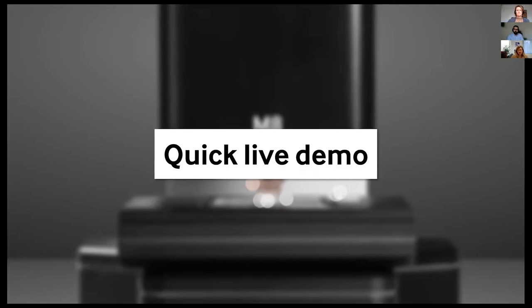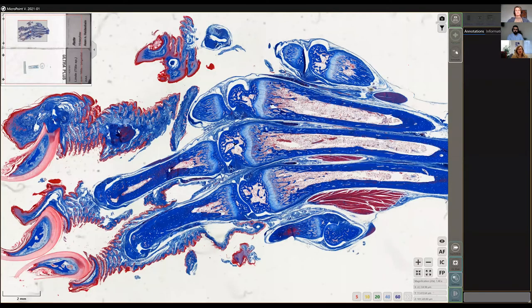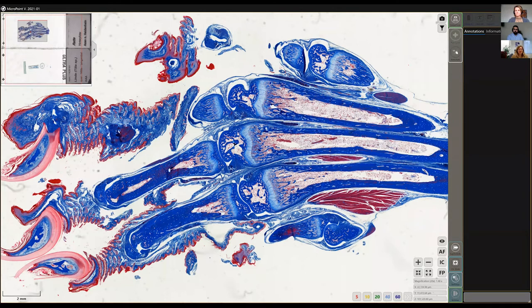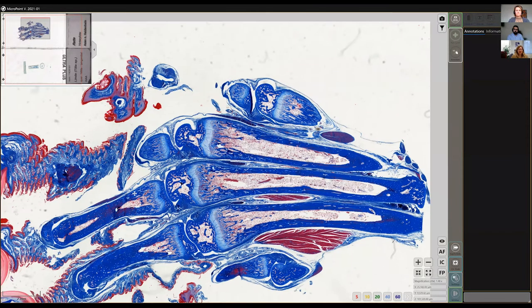I'd like to give you a live demo. I'm sharing my screen to show you the user interface of our digital slide scanner. We have two different main modes: the scan mode, where you create a digital file you can later analyze, and a live mode called Instant Scan. The live mode basically allows you to look at a sample in real time.